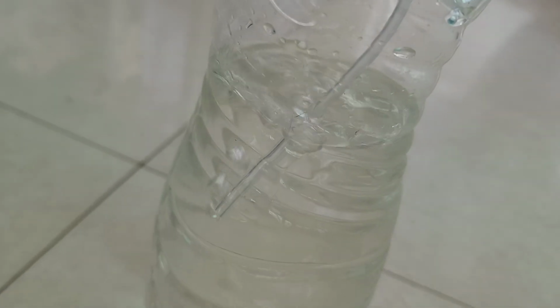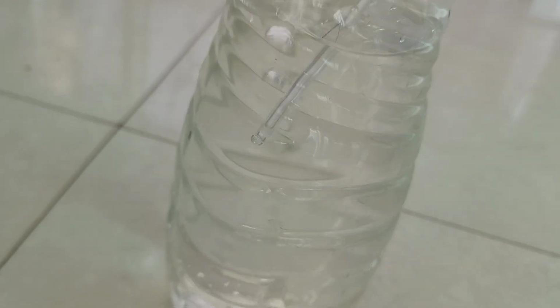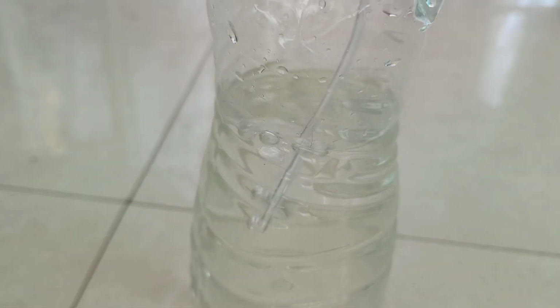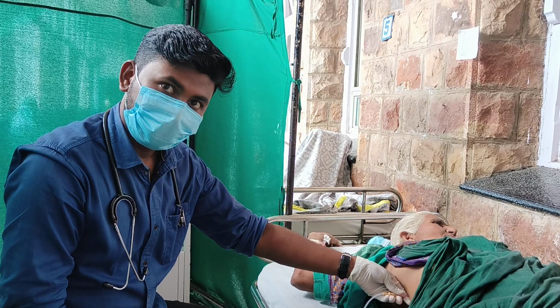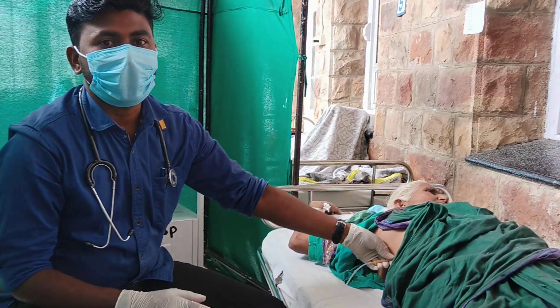So this is one important procedure. The bubbles coming from this directly remove the air from the pleural spaces. You can see this beautifully. Now air is still coming. So what is this procedure? How does it work?